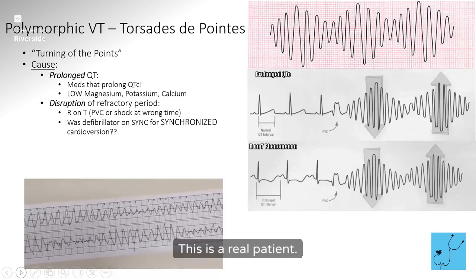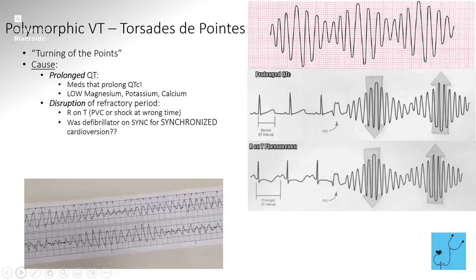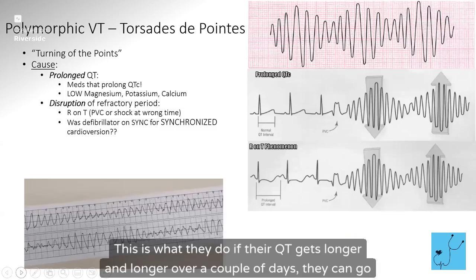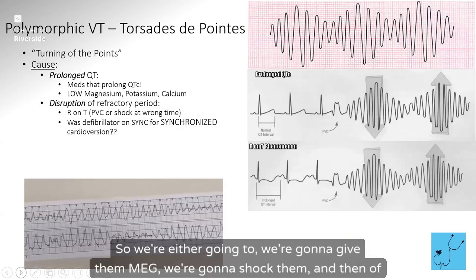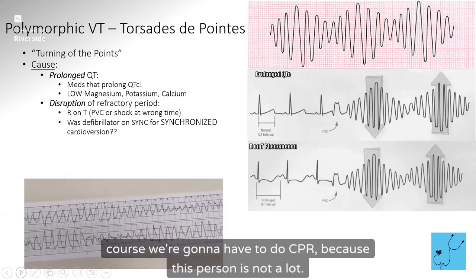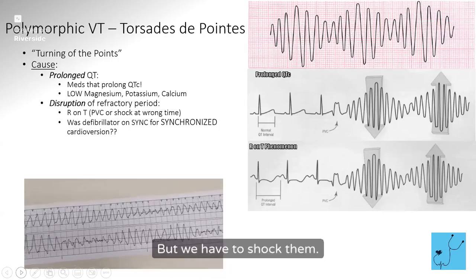This is a real patient. This is a torsades. You can see how it gets big and then small. This is what they do if their QT gets longer and longer over a couple of days. They can go into this torsades. So we're going to give them MAG, we're going to shock them, and then of course we're going to have to do CPR because this person is not alive anymore. Okay. But we have to shock them.